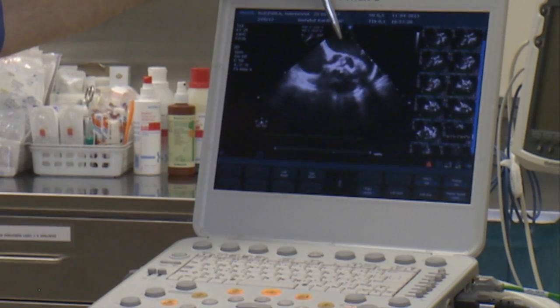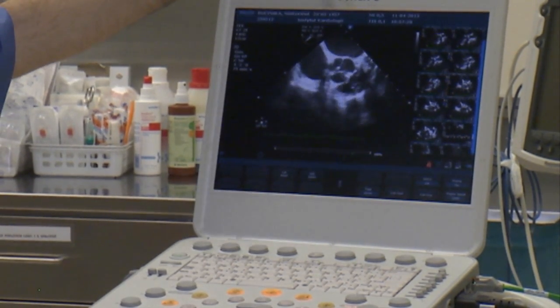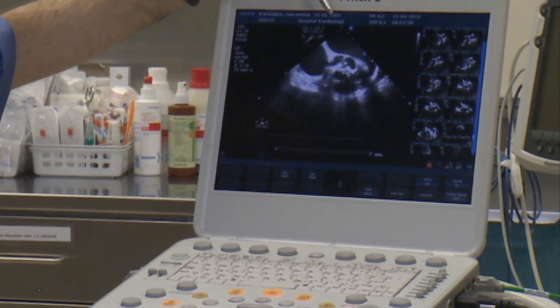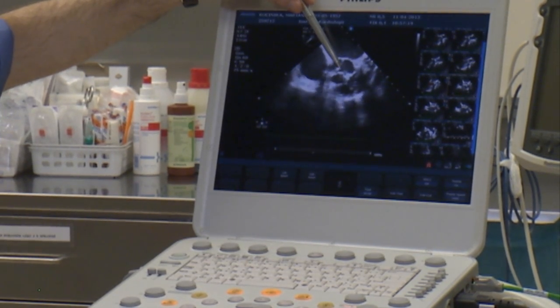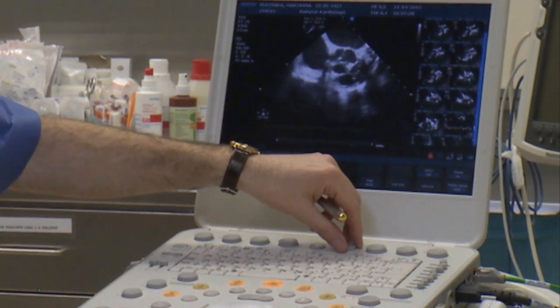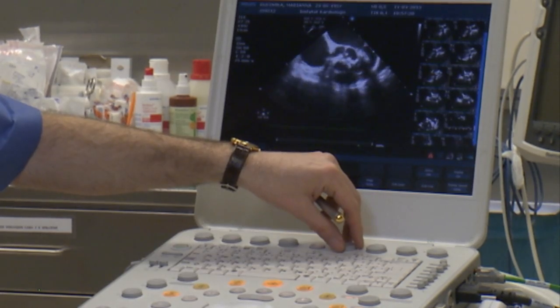Now you see the valve itself, it's a tricuspid valve. It's not as calcified as you might expect in the case of rheumatic or degenerative valve disease, but this is following radiation therapy. Still, the opening of the valve is very poor, and as I previously said, there is also a significant aortic regurgitation. Altogether, significant aortic stenosis and significant aortic regurgitation made us perform the procedure.